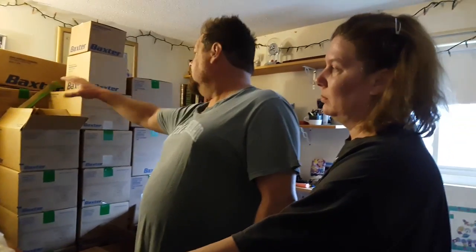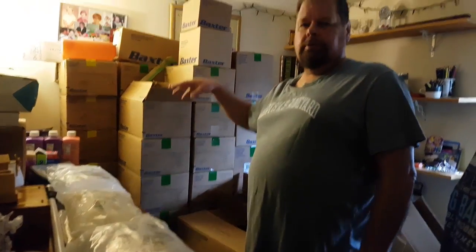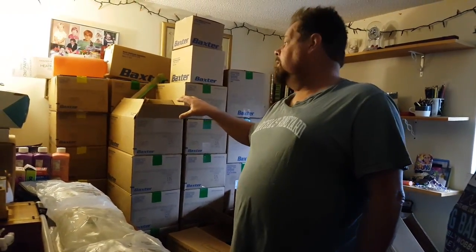And there's different color solutions. There's a red box, a yellow box, a green. They're for different problems, when you have different problems with your blood, or if you're diabetic or, you know, anything like that. They take out different amounts. They're different strengths. So, but I'm using the green, which is the middle one, and that's the more common one, I guess, would be a better word.